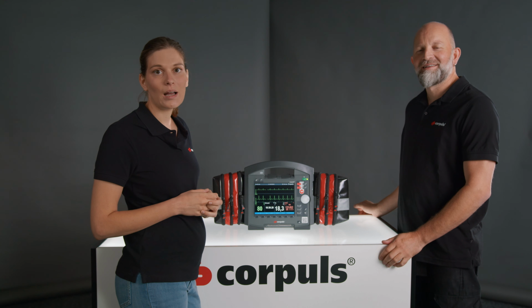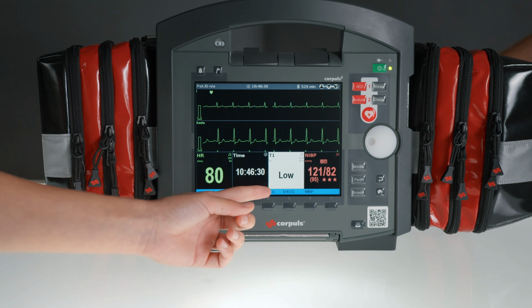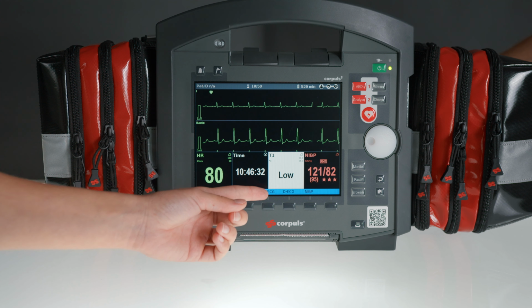In the temperature area, we now have a new additional message that appears when the sensor's measuring range is below 12 degrees. Low then appears on the display.